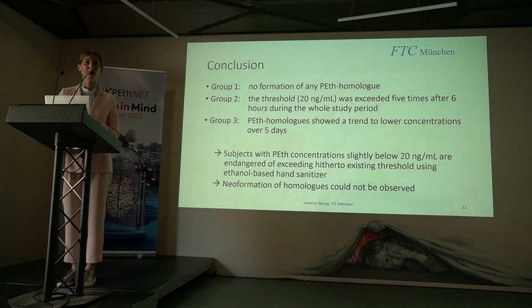Thank you, Josefine. Interesting presentation. Do you know whether the cards were stored away from the alcohol? We know that, for instance, using the volumetric absorptive microsampling tips, if those are exposed to alcohol, they can actually absorb the alcohol, even if they haven't been in touch with blood yet. Yeah, in our laboratory, we're not allowed to use any ethanol-based hand sanitizers, so we only did this with lab staff, and they had to go outside of the laboratory, use the ethanol-based hand sanitizer over there, and then come back inside and do their work. So the ethanol-based hand sanitizer is far away from the laboratory. But I mean the cards as well. So the cards are in the lab.